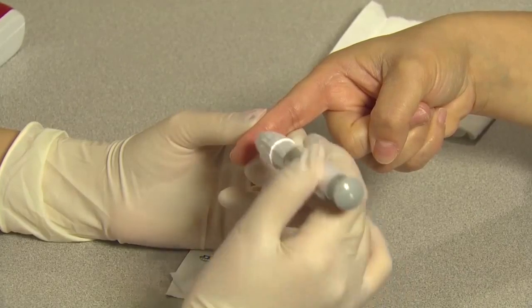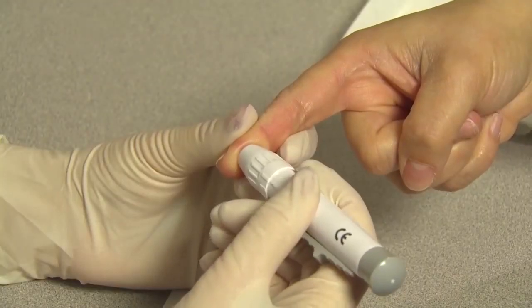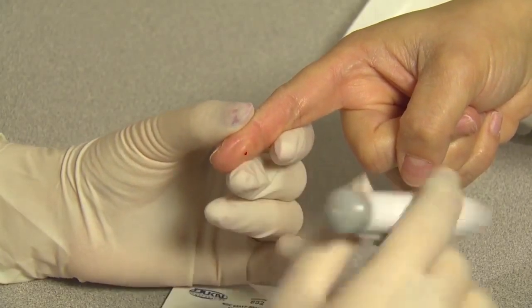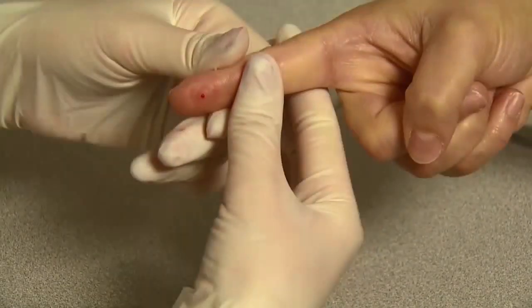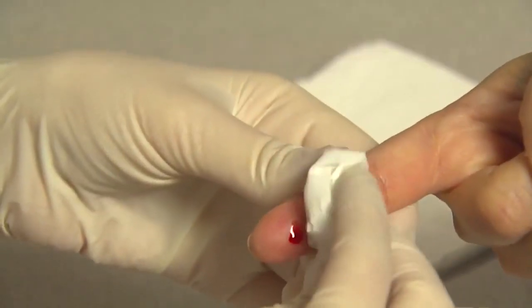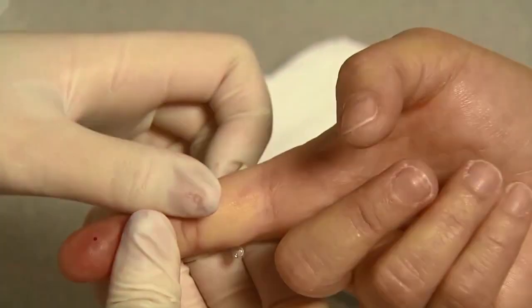Hold the lancing device against the side of the finger to be lanced with the cover resting on the finger. Push the release button to prick the fingertip. Gently massage the surrounding area toward the puncture. Do not excessively squeeze the finger. Wipe away the first drop of blood. Apply light pressure to obtain a second drop of blood.